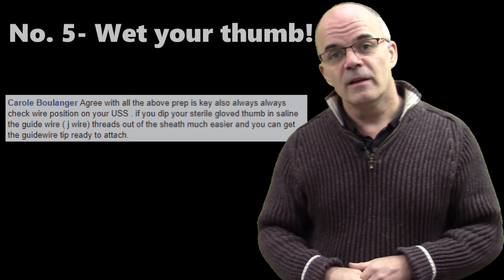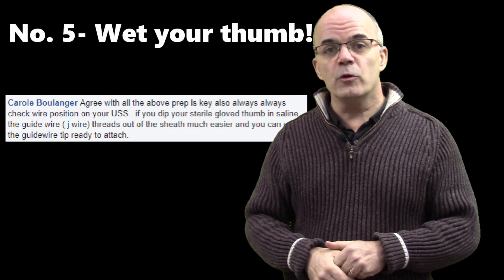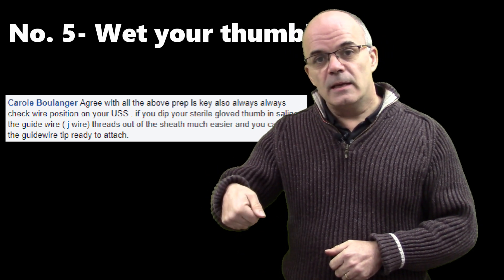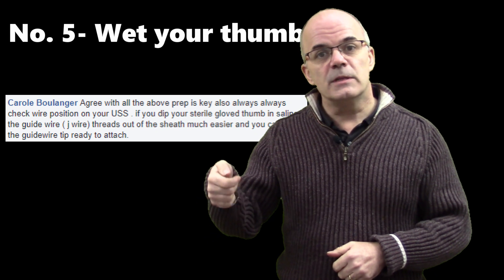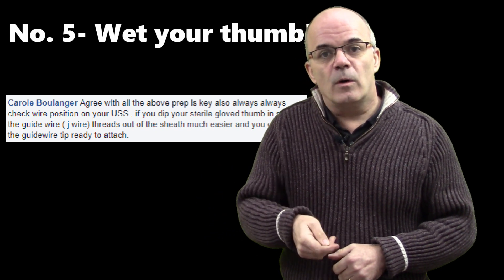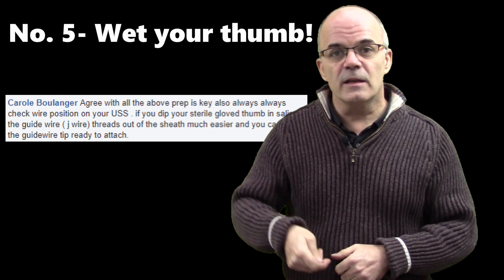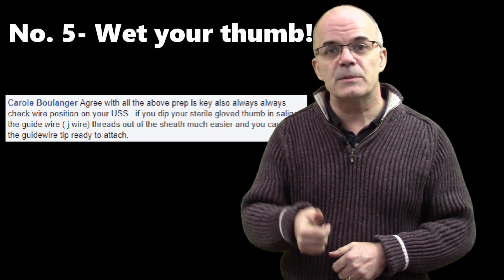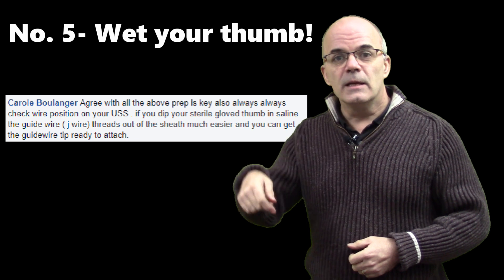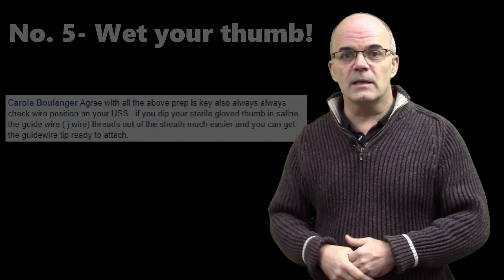Number five — and this is from Carol, and again one I hadn't encountered before. Before you start the procedure, dip your thumb into a bit of saline — obviously with your sterile glove on — and that will make feeding the guide wire much easier. The problem with a dry thumb, which I've found many times, is that your finger just slips off the guide wire and the guide wire doesn't move. But as Carol says, dip your thumb in a bit of saline first and that gets over that problem. A great tip.